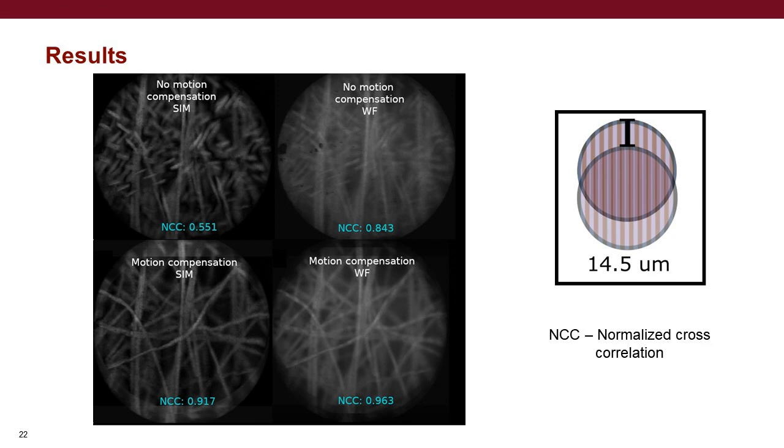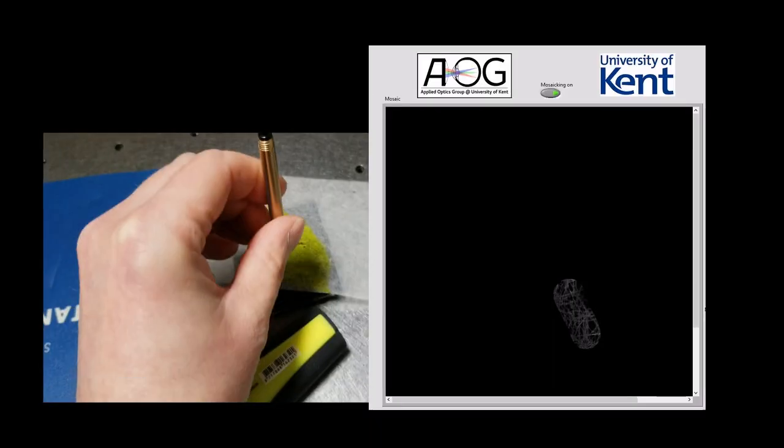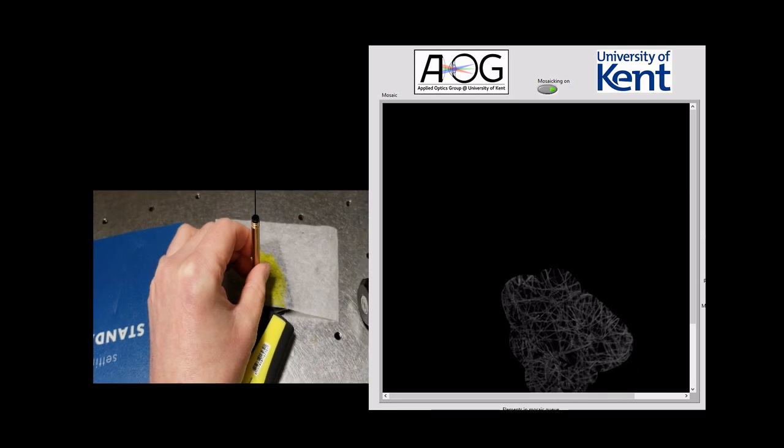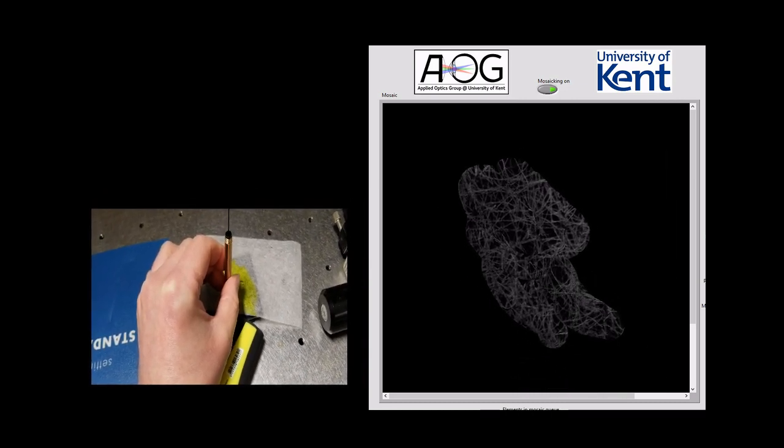Problems happen because this is a 3-frame acquisition process. Any motion between the 3 frames leads to artifacts, and the hope is, with a few more improvements in the motion compensation, you would be able to reconstruct artifact-free structured illumination images that make the way towards high-speed mosaics.